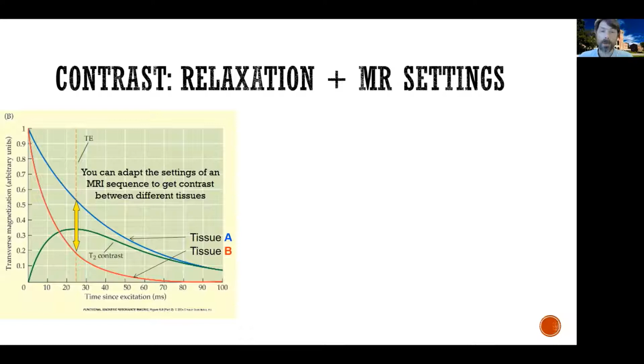So we were talking about relaxation. We were talking about what happens when you stop a radiofrequency pulse and protons slowly realign into B0. And we said, as they do this, there are two aspects to relaxation. One is about dephasing. It's about protons losing coherence in the XY plane, or T2 relaxation. And one is about recovery of the projection on the Z-axis. So it's about protons realigning back into the field and going back to pointing up straight into B0.